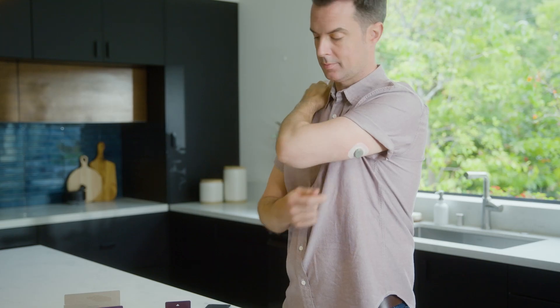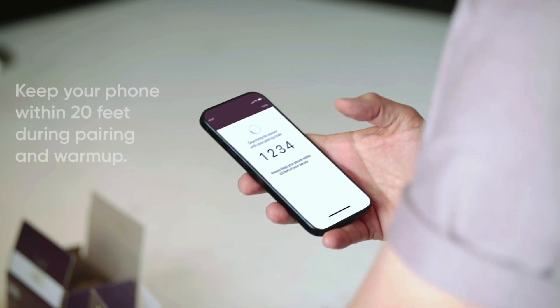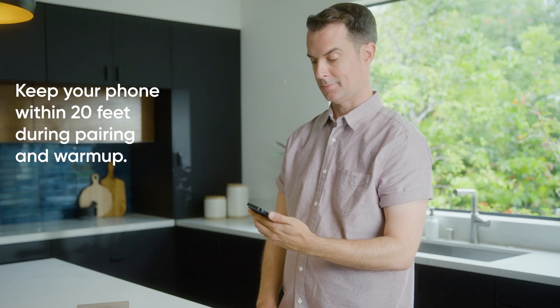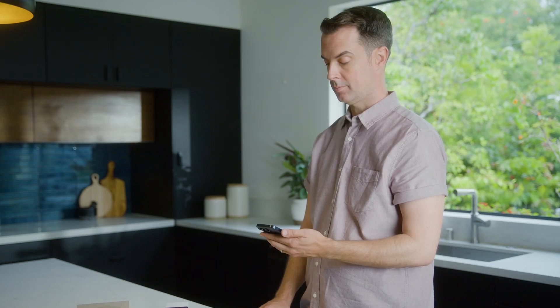Back on the app, enter your pairing code. You'll find it on the applicator you just used — you can just take a photo of the QR code. Wait for your sensor to pair. When it does, you'll enter into your sensor warm-up. The timer will let you know when you'll start getting readings. And that's all there is to it. You're ready to go.